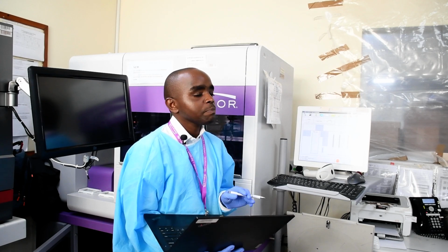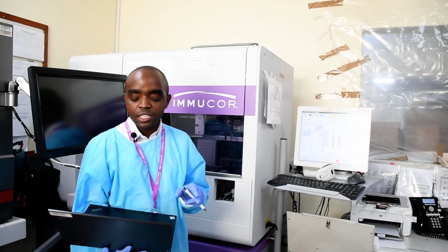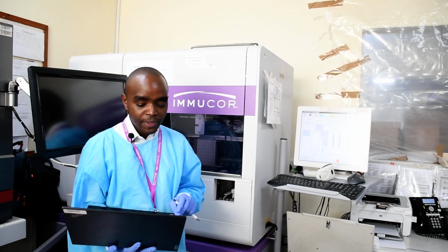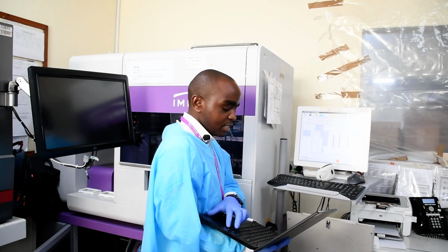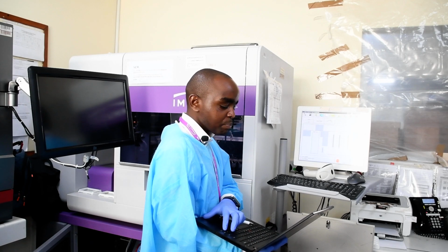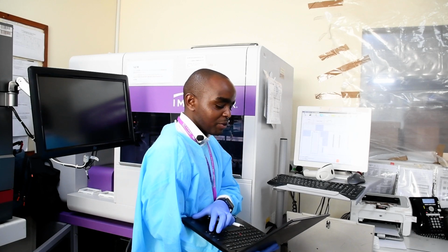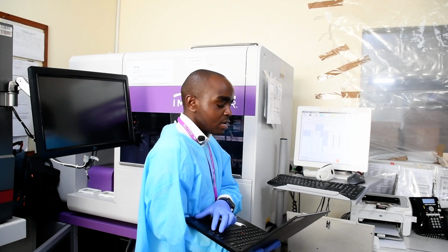So for post-transplant patients, but also for your case, especially the platelets transfusion, this is something that is being recommended more and more. In Europe, it's being done almost as a mandatory test, even after you have done the major cross-match.